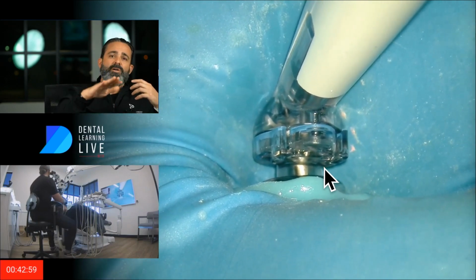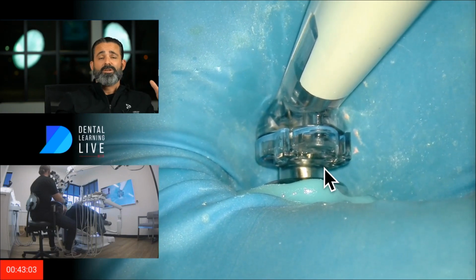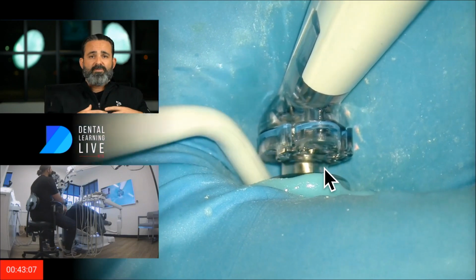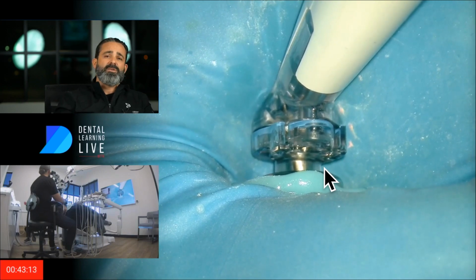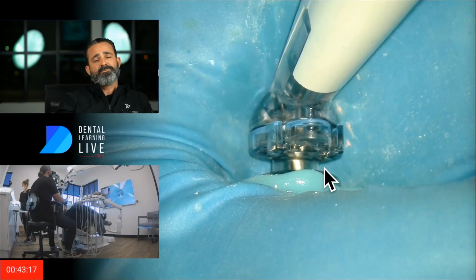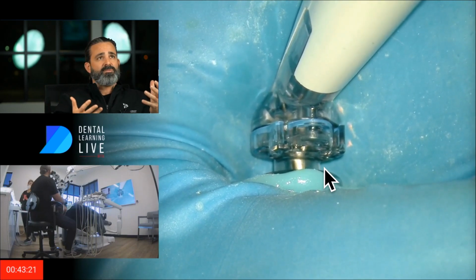Bernoulli's principle going over an empty space, meaning the canals, creates negative pressure. So those are the mechanisms of action physically. Then we have chemistry, and we say advanced chemistry only because of adding the physics to it, which accelerates it as an accelerant. And those are essentially, in a nutshell, how GentleWave works.